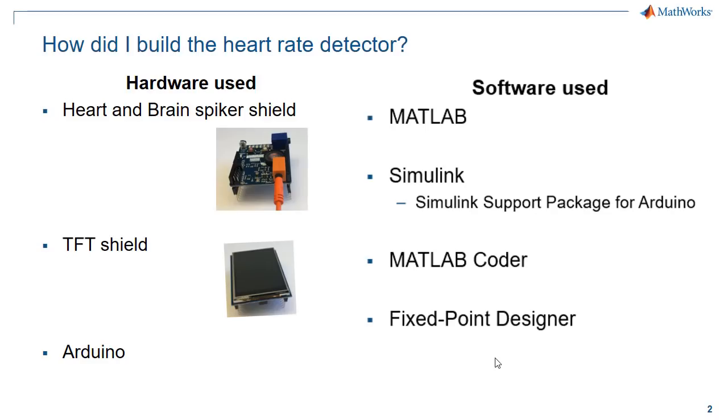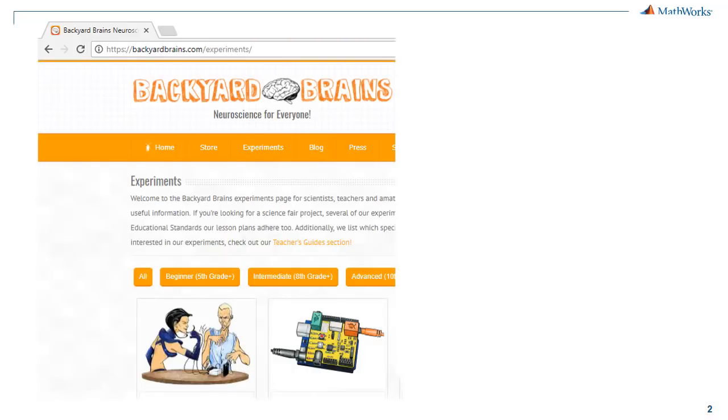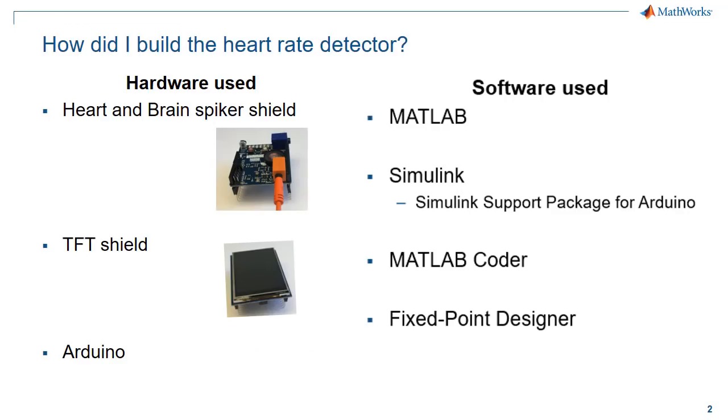So I'm using a heart and brain spiker shield to bring the ECG signal from the real world into Arduino. This shield is part of a bundle that is created by backyard brains. They make different hardware bundles and experiments that go with them, which makes understanding neuroscience concepts simple and fun. The TFT screen that I'm using allows me to plot the signals and display the heart rate value at the same time. And the Arduino that I'm using acts as the brain here.